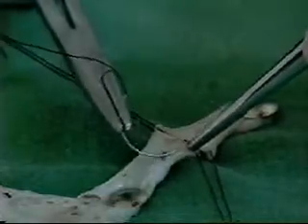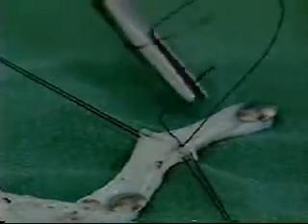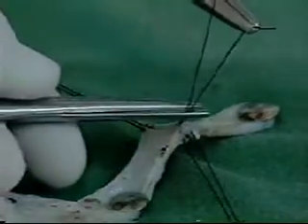A single layer of interrupted sutures, again applied in an extra mucosal fashion, is then started. Once the single layer of the anterior part of the ureter is applied, the two stay sutures are tied and still held on the artery forceps.